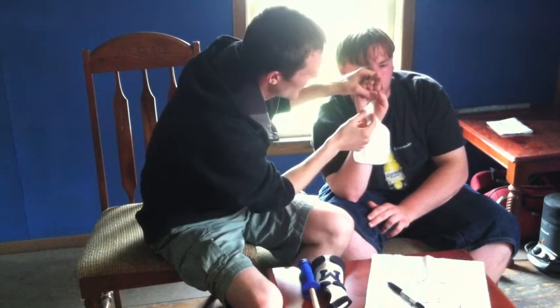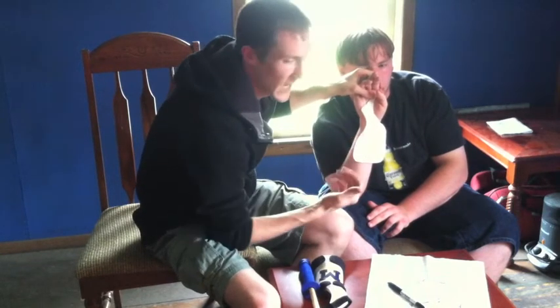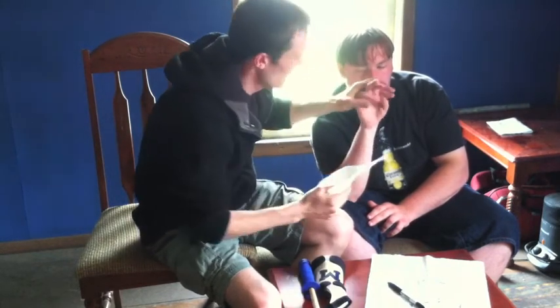So it's really important that this stays up in there and that we don't cover those creases, because if we do, that obviously is going to rub when he's using this, and it's just not going to be as functional. So thanks, Nick.